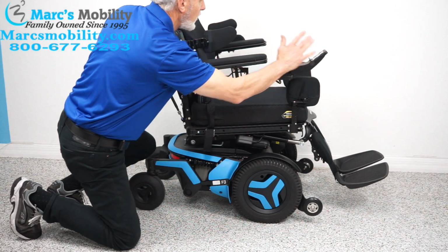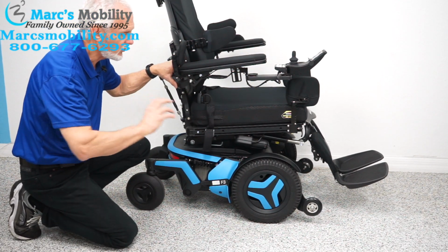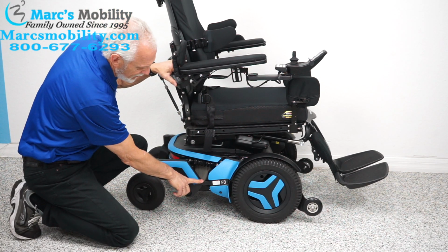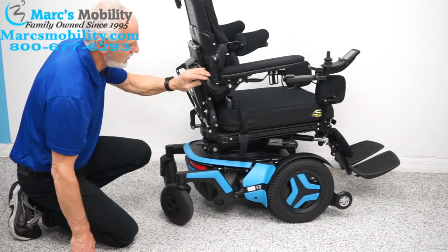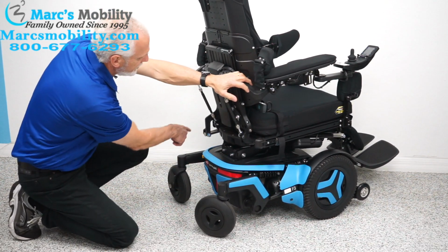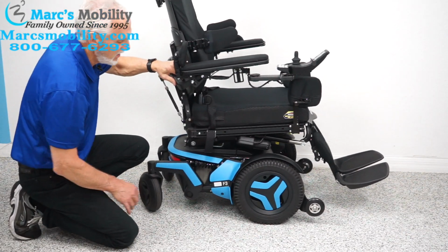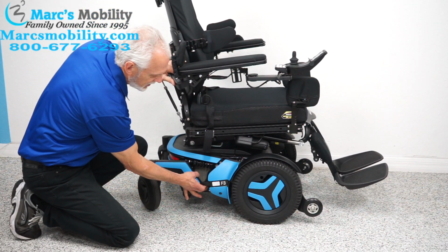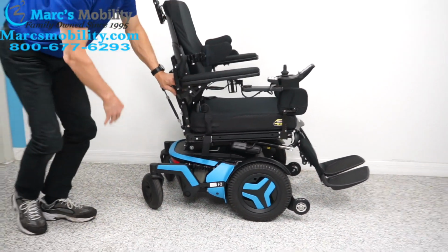But if you turn the power off, and all these chairs always have a release so you can roll them. The release on this one is that little handle right there. If you push it down, see that? Now your front wheel is unlocked. If you do both motors on both sides, you can roll the chair around, okay? When you're done rolling it, put the motor back in gear, and you're back in gear, okay?